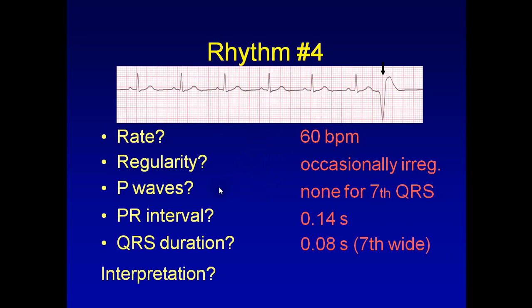So what does that mean? It means sinus rhythm, but with one premature ventricular ectopic or contraction. Why ventricular? Because the QRS complex is a different shape from normal. As we said, if the impulse originated in the SA node, atria, AV node, or bundle of His above, the QRS complex will be normal. But if in the ventricle, the QRS complex looks abnormal, and the T wave is in the opposite direction. This is a T wave, this is a T wave.